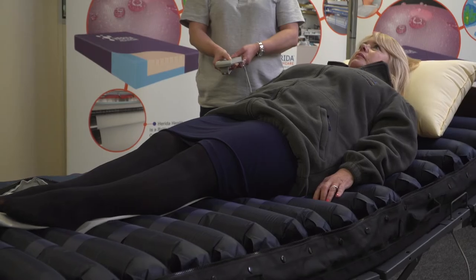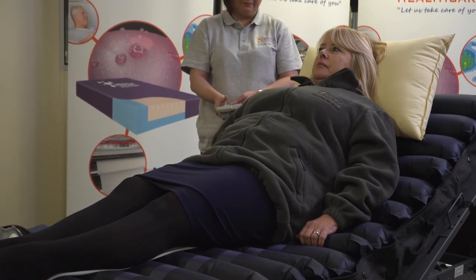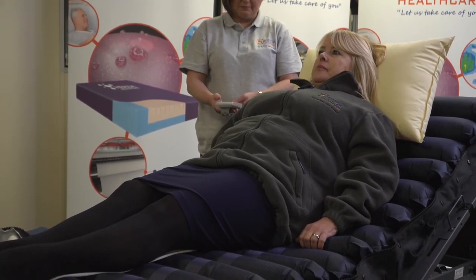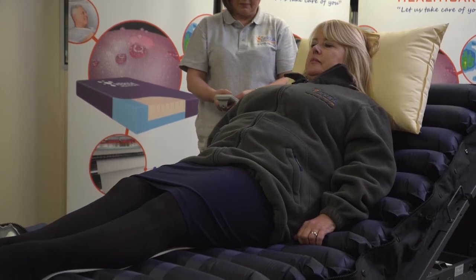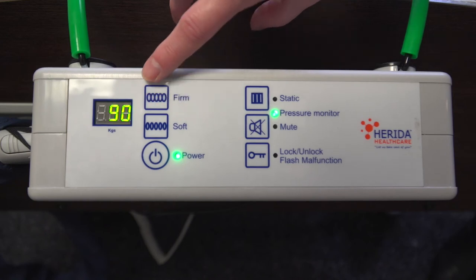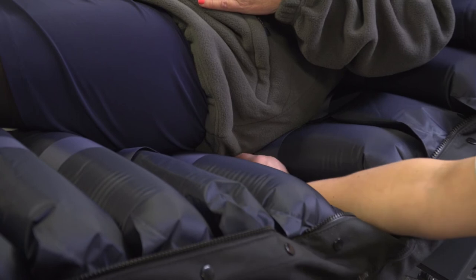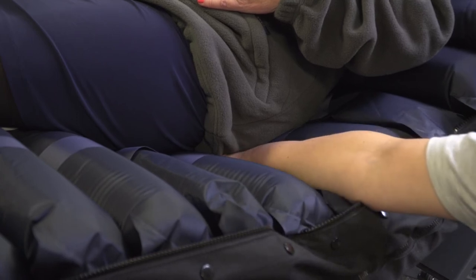The second layer of cells stay fully inflated at all times, giving the patient the comfort and support they require. When the patient is sat upright for extensive periods, please ensure that sufficient pressure is in the cells underneath the sacral area. If insufficient pressure is evident, then the pressure may need to be increased.